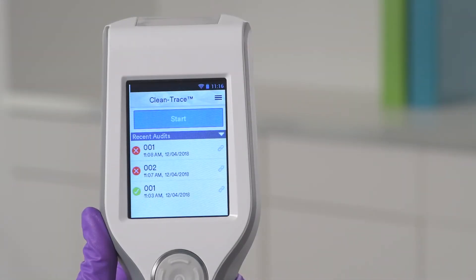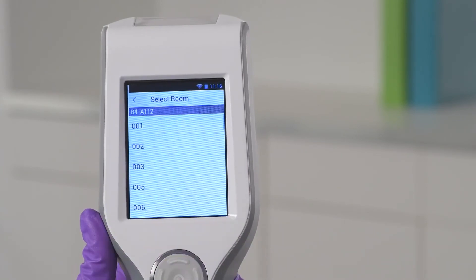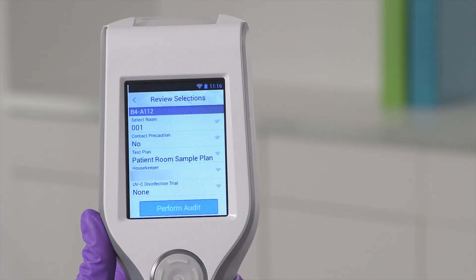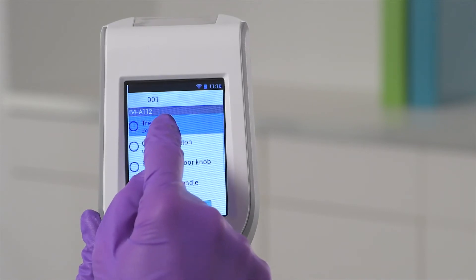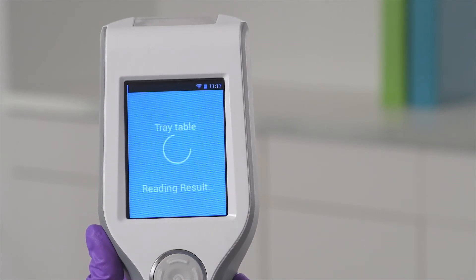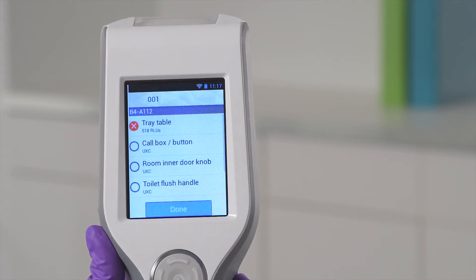Your options will be different if you are using the Clean Trace system to monitor environmental surfaces. You'll tap Start, then select an area, then select the room. On the Review Selection screen, you can change the room, flag contact precaution, change the test plan, select the housekeeper, or select the value for any user-defined fields that have been set up. When you are satisfied with your selections, tap Perform Audit. Select a test point, then insert the ATP test into the test chamber and tap Begin Measurement. In 10 seconds or less, you'll see the result — a quantitative RLU value and a pass-fail response for the test point you were testing. After your result is displayed, tap Return. Repeat this process until all test points have been tested. Tap Done when complete.